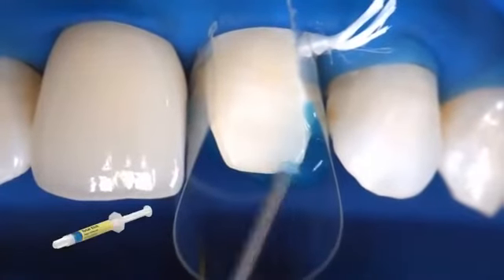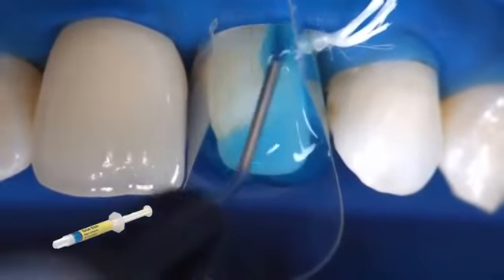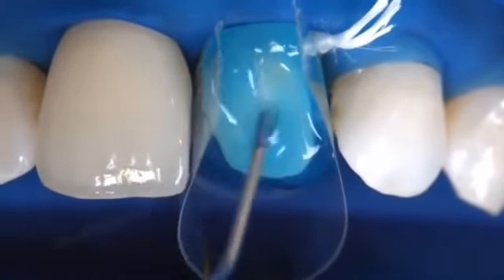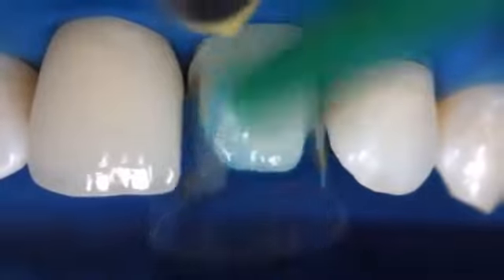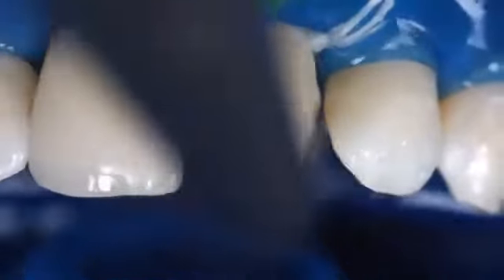Apply phosphoric acid gel, for example Total Etch, to the enamel and allow it to react for 15 to 30 seconds. Thoroughly rinse off the gel with a vigorous stream of water and air-dry the preparation until the enamel surfaces appear chalky white.